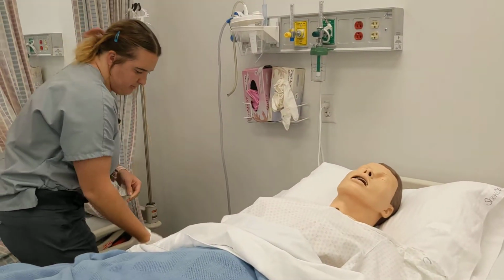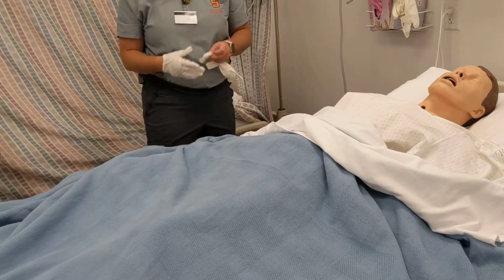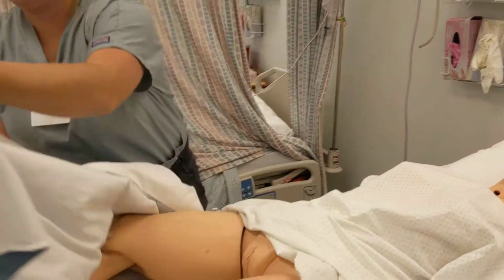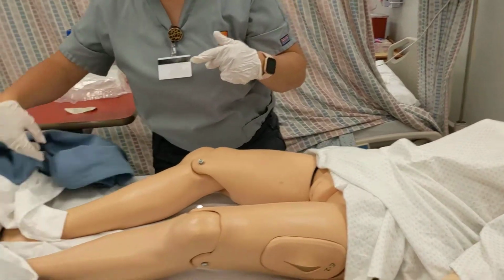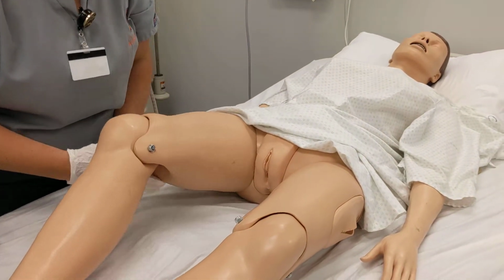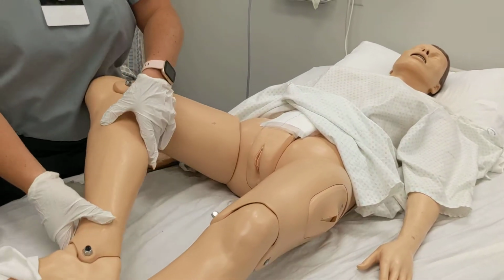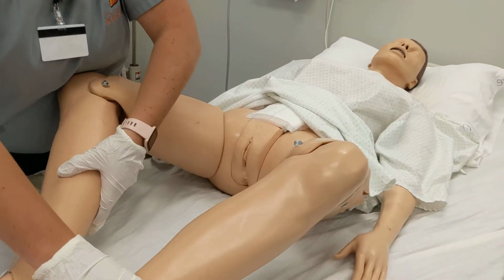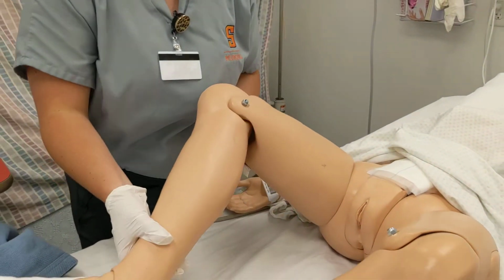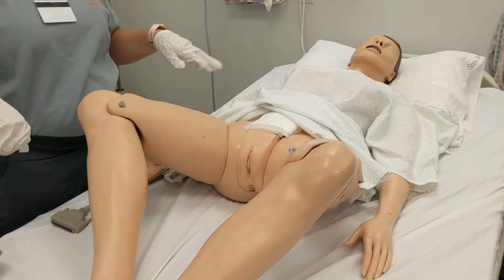Our leg bed doesn't look super even, so I'm gonna put the legs down. Okay, so first I'm going to put this down. We still have our privacy. I'm the only one right here. So I am going to put the patient's legs like so. You just put their legs together, let the knees kind of drape out naturally to give us the best working space that we can have. Okay, so Esther says that she's comfortable.